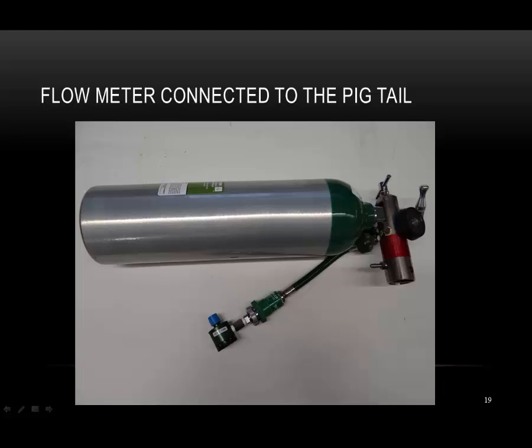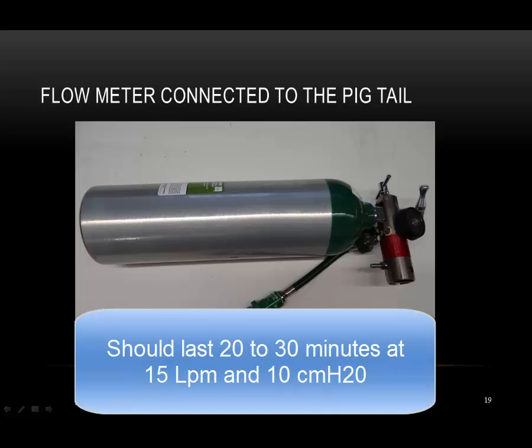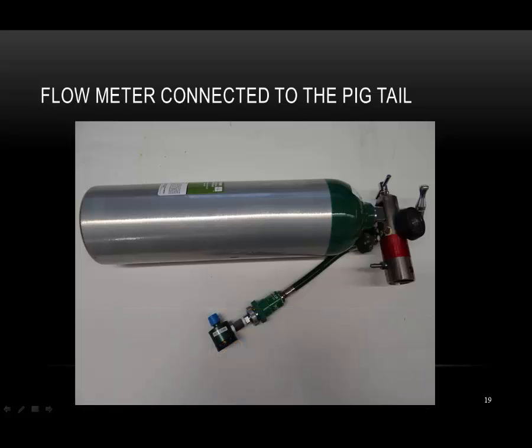At 10 centimeters of water pressure and 100% inspired oxygen at a flow rate of 15 liters per minute, a size D oxygen cylinder will last between 20 and 30 minutes. At 65% inspired oxygen, a size D oxygen cylinder may last up to approximately 35 minutes. Regulator-based systems are often compatible with end-tidal capnography and inline medication nebulizers.